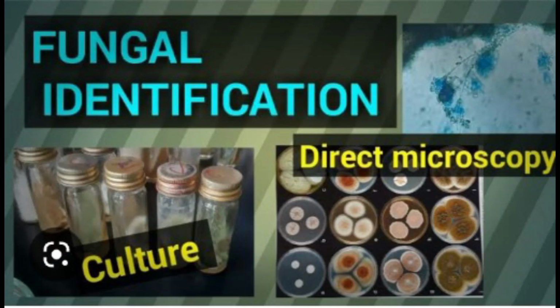Identification of fungal cultures. To identify a fungal culture, besides macroscopic examination of the fungal growth and microscopic examination, techniques such as lactophenol cotton blue wet mount, Gram staining, Indian ink preparation, germ tube test, slide culture, etc. may be required.